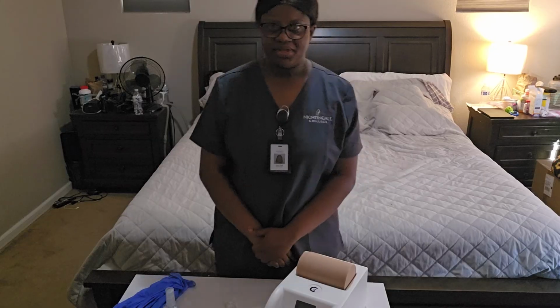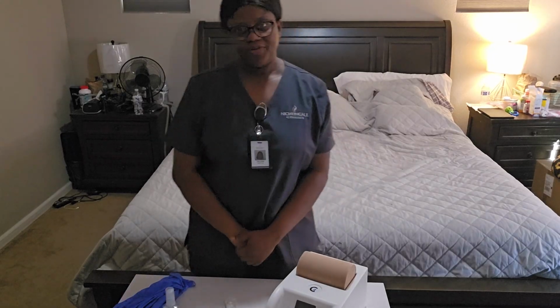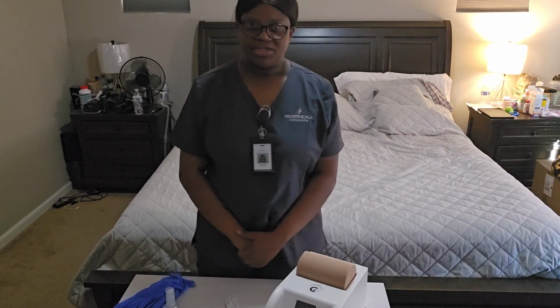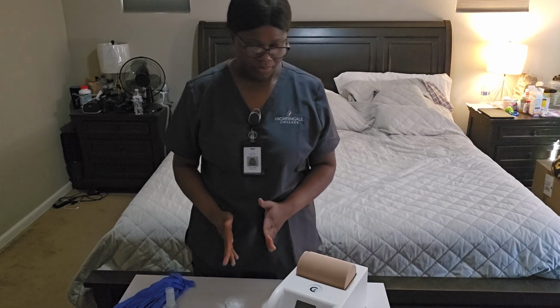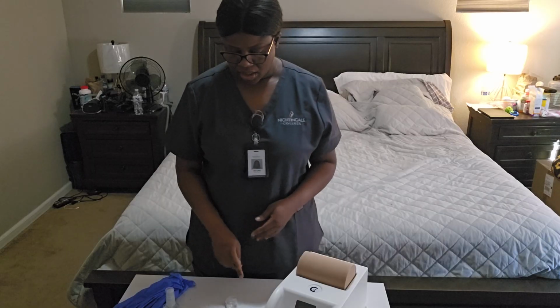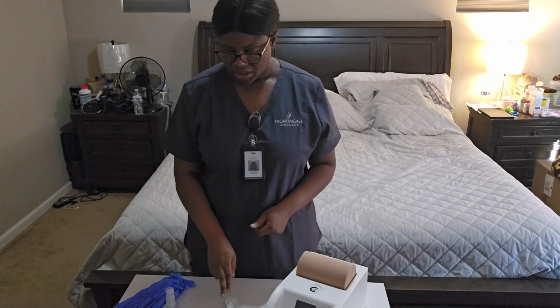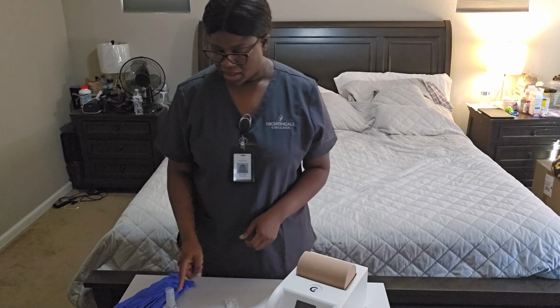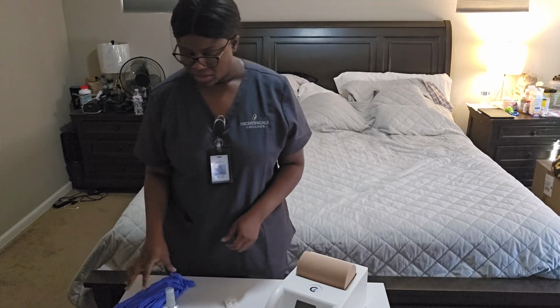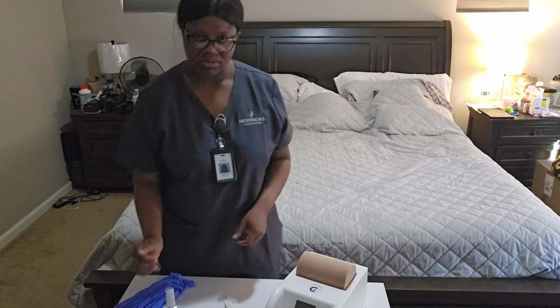My name is Intradermal. Today I'm going to be performing the intradermal injection. Here I have my supplies: my patient's syringe, medication, alcohol pad, hand sanitizer, gloves, and gauze.